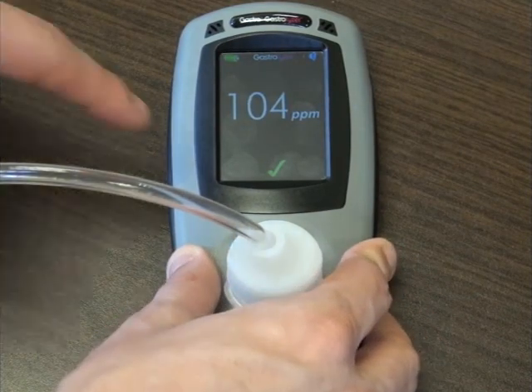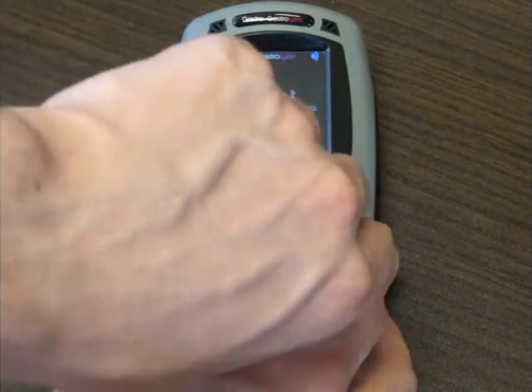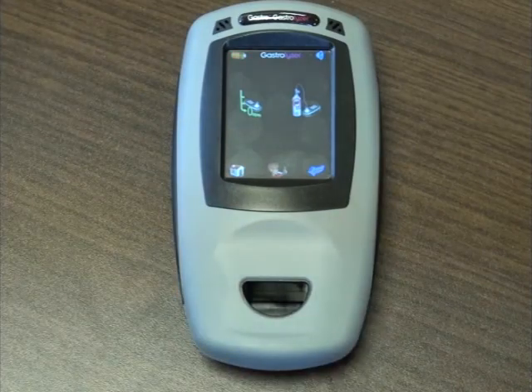To finalise this process, press the tick button when it appears. You can then remove the D-piece and turn off the flow valve on the calibration gas canister.